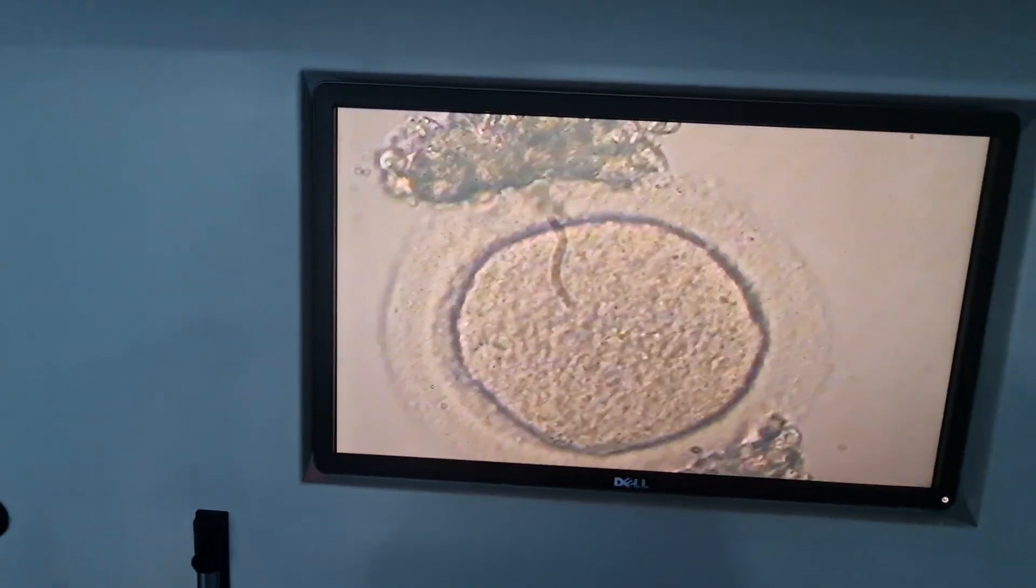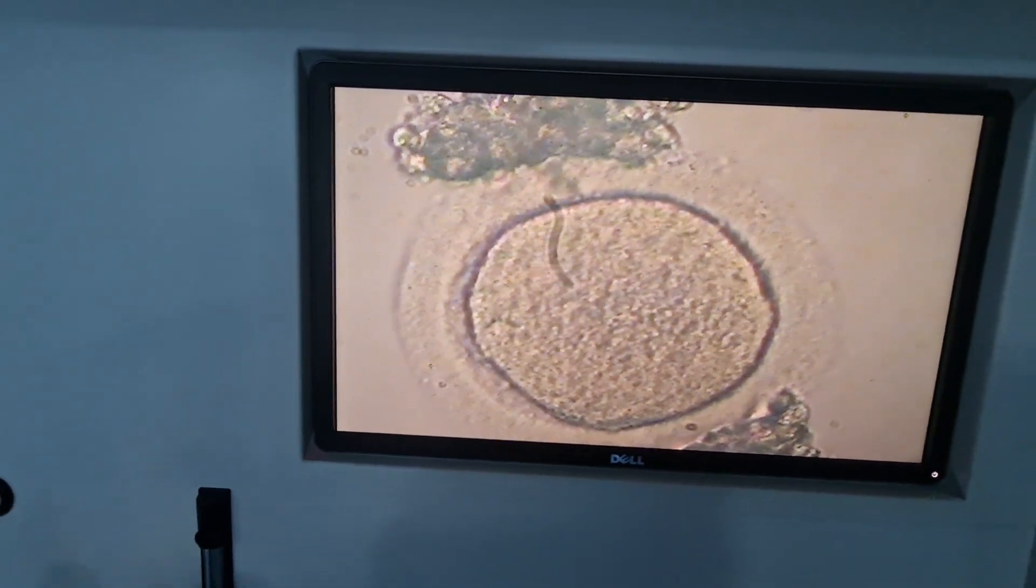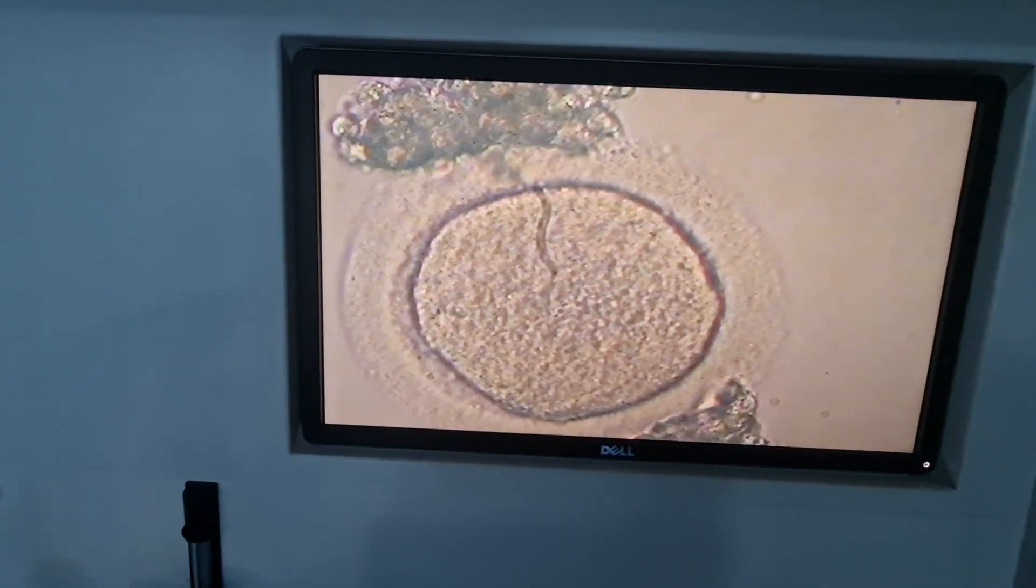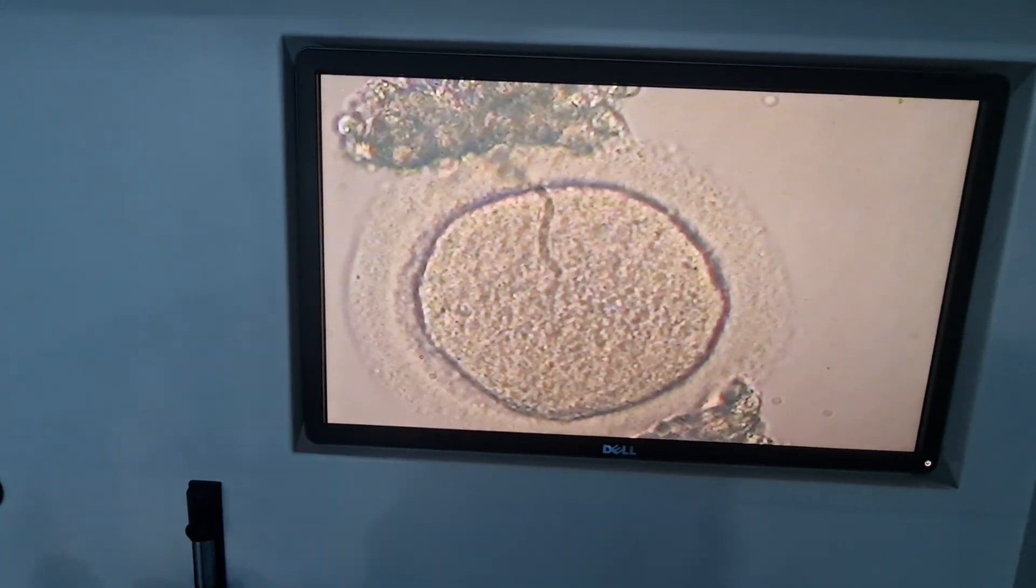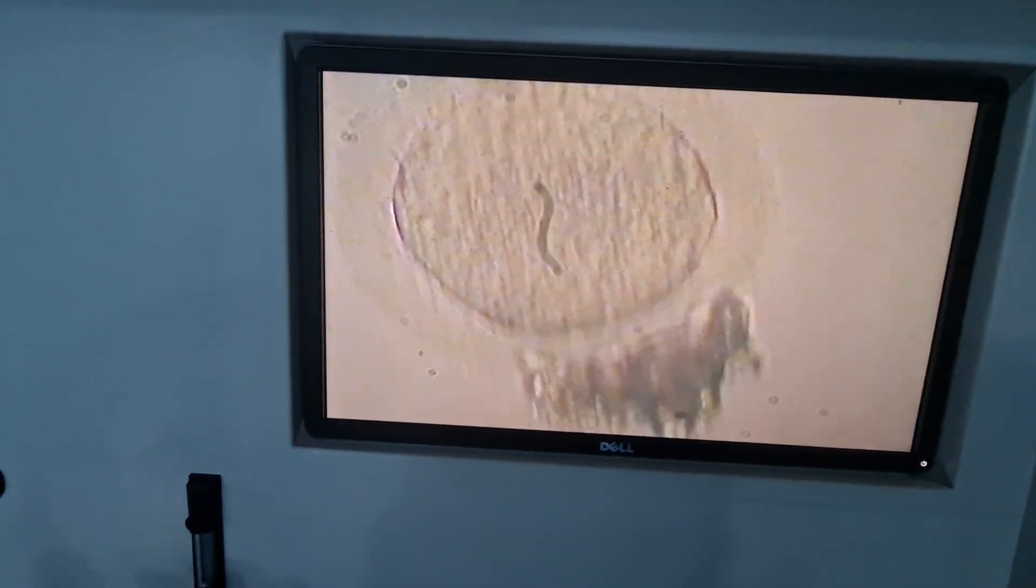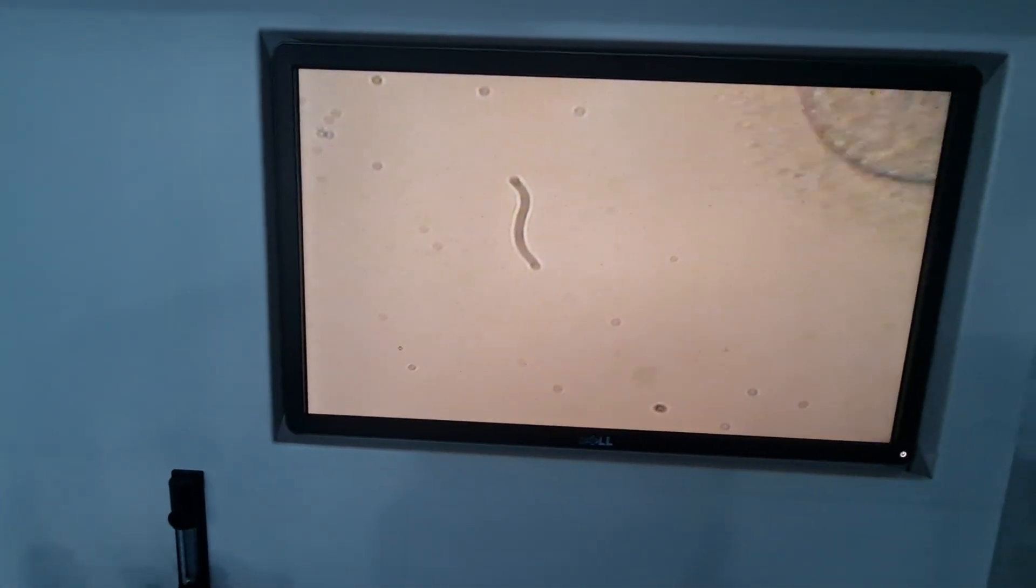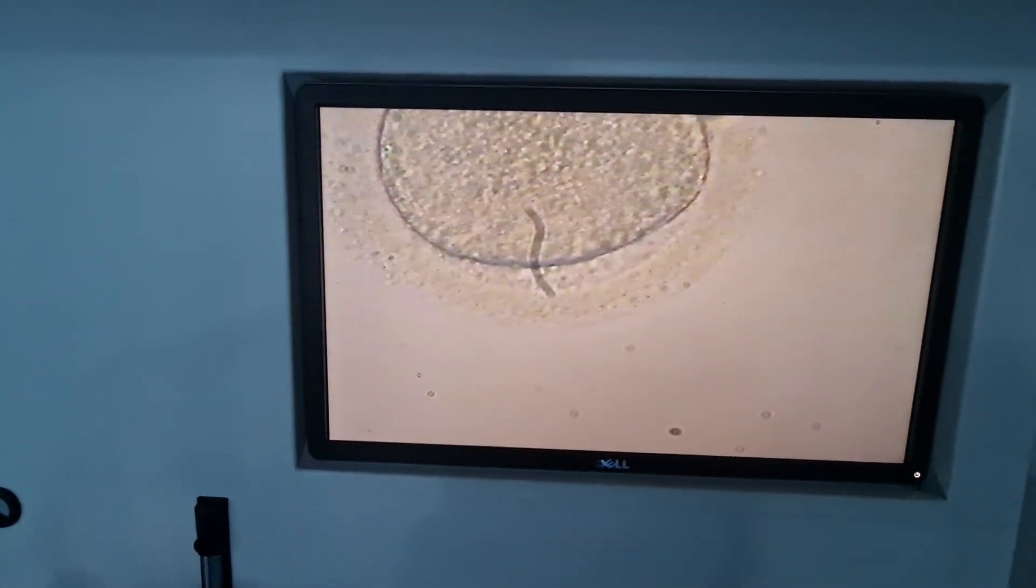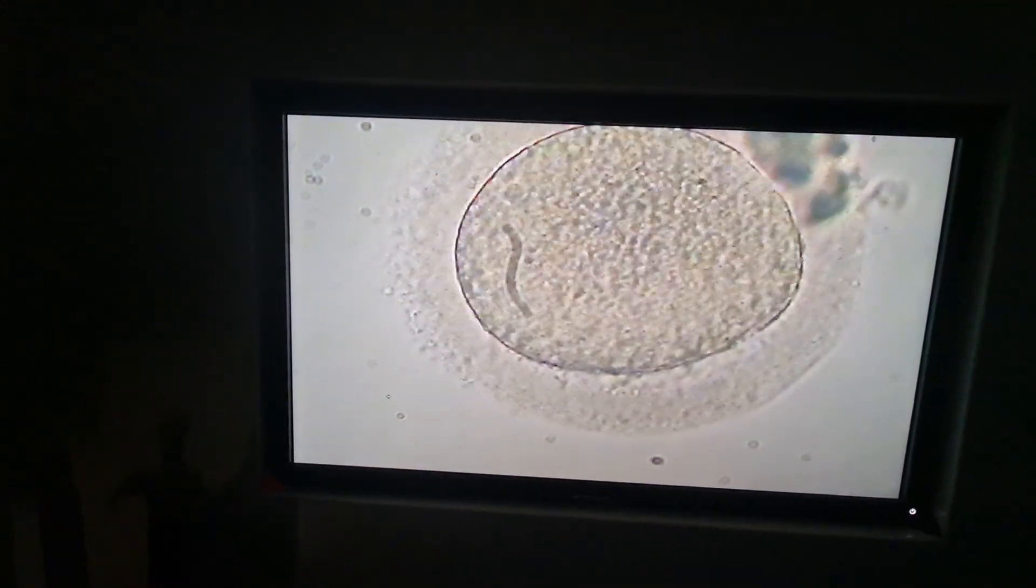We cannot see a polar body between the zona pellucida and the oolemma. These cells are all granulosa cells. You can see no polar body.